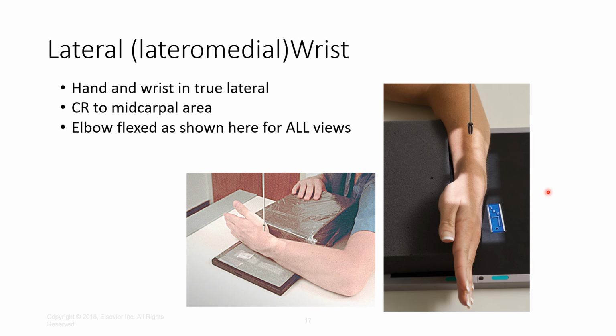Still 40-inch SID to tabletop, still 65 at 1.2, or collimated to the part size, ideally smaller than an 8 by 10, so you wouldn't change your collimation between these images. You would just keep it what it was and potentially have to alter just a little bit to fit your marker.